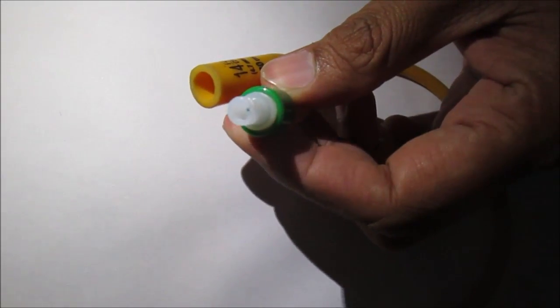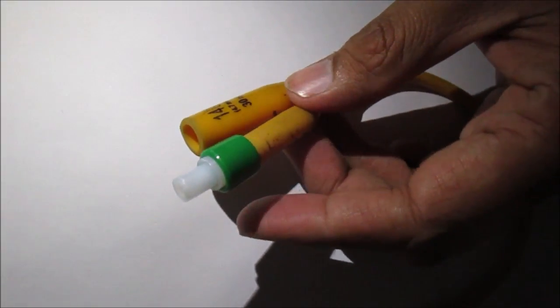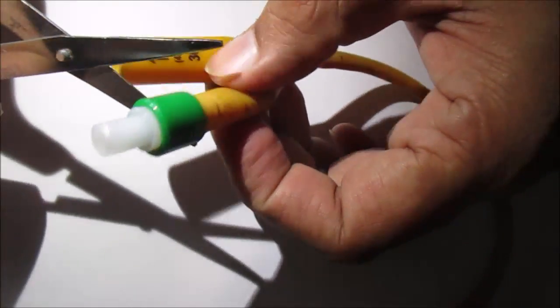Insert it in the Foley in the route that is the pathway of the water. It will work.